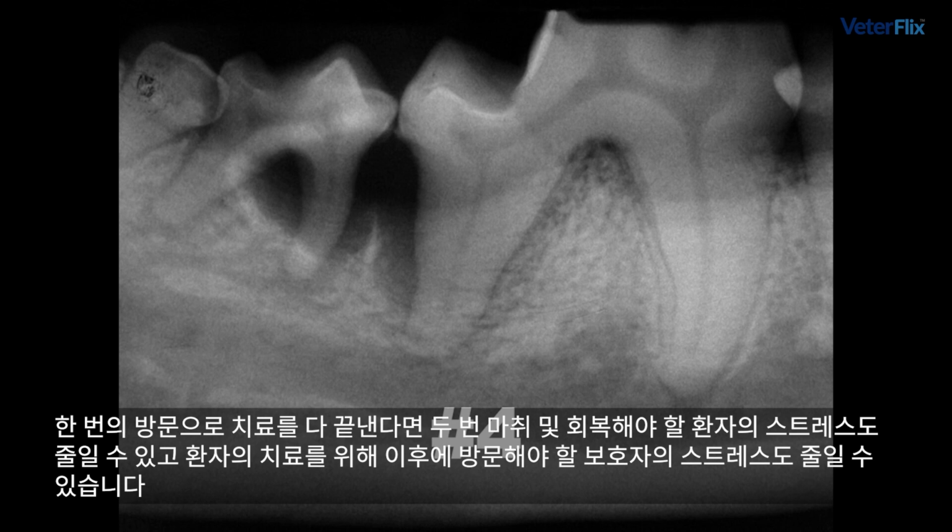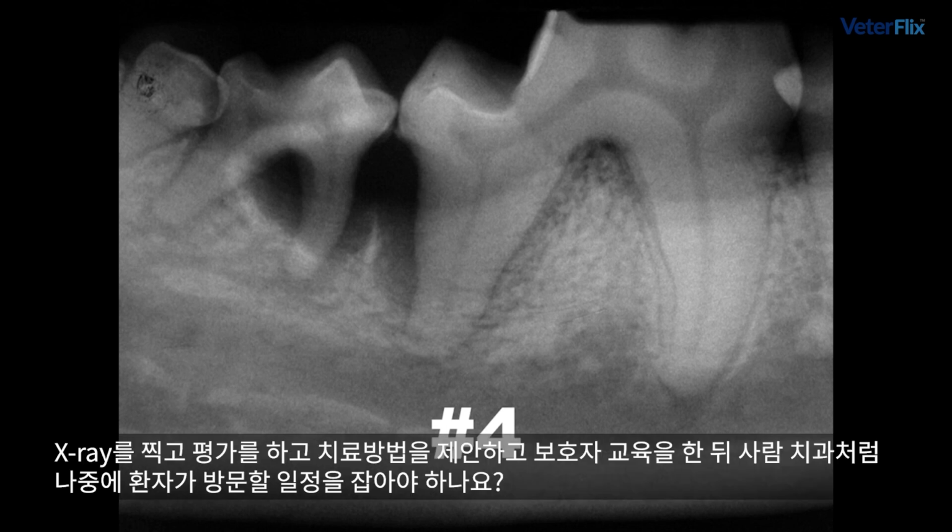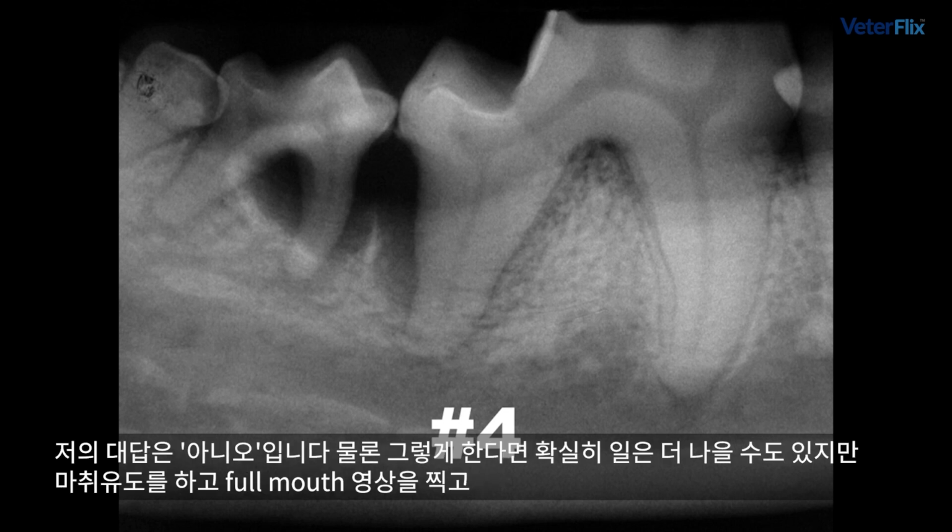And that's a common question in our lectures from the audience. Is that something that we should be doing? Should we be taking our radiographs, making the evaluation, making the treatment recommendations with client education, and then scheduling like our human dentists do and get the patient back at a later time? And my answer to that is no. And if you're doing that, then it can definitely work better the other way.